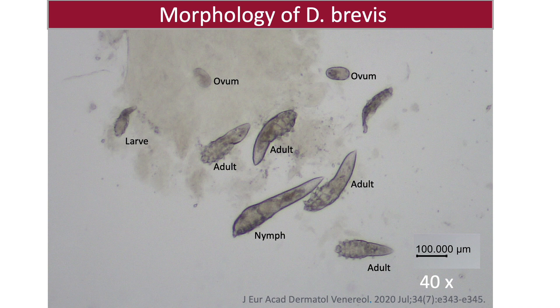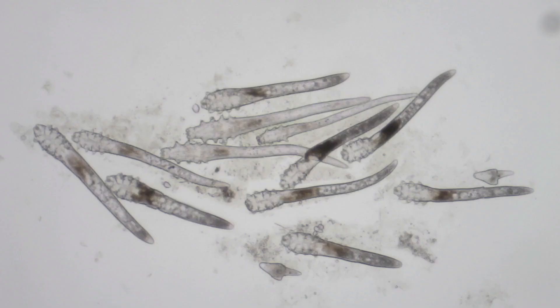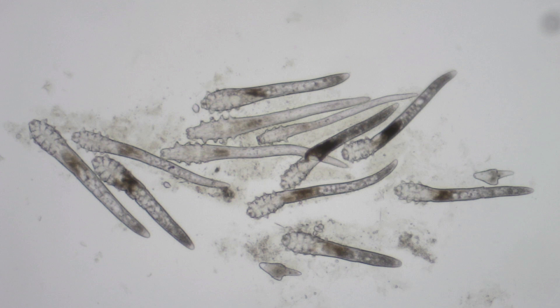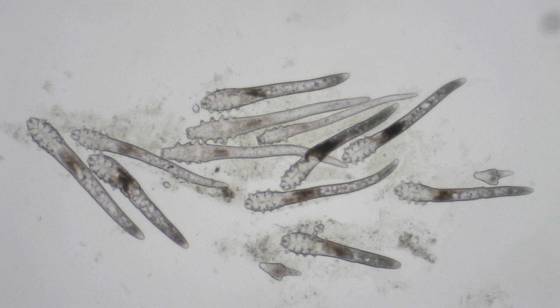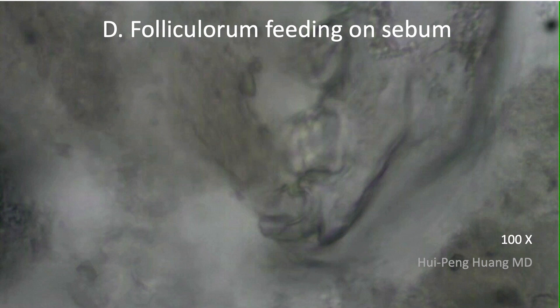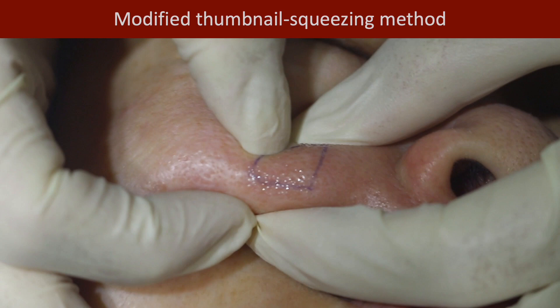The most consistent morphological character of D. brevis is a cone-like terminus. Here is the D. brevis mite, showing oval eggs and bodies with cone-like terminus. All the developing stages of Demodex mites and their mobility are well identified. In contrast to the silent immature stages, D. folliculorum was very mobile when just squeezed out of the follicle.